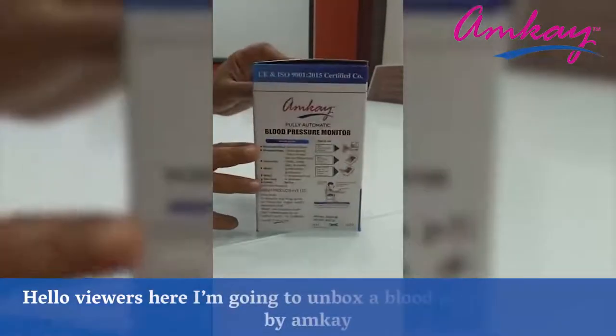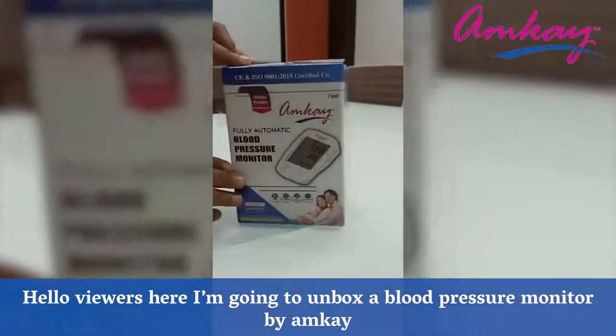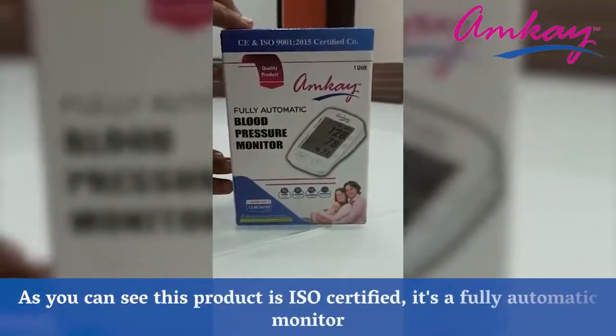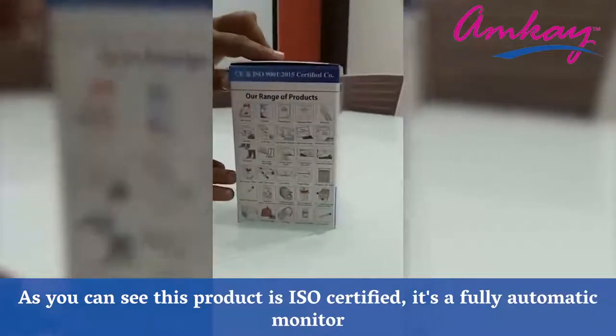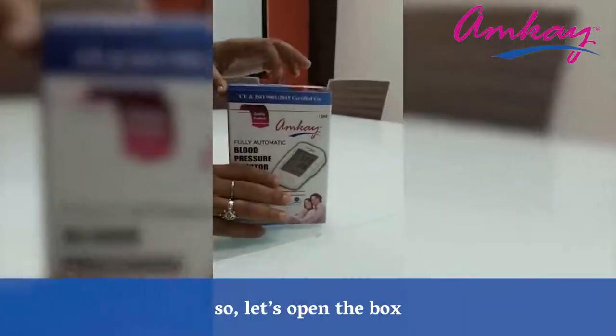Hello viewers, here I'm going to unbox a blood pressure monitor by Amkay. As you can see, this product is ISO certified and it's a fully automatic monitor. So let's open the box.